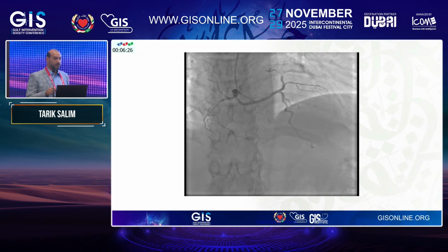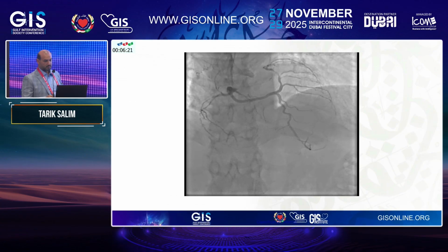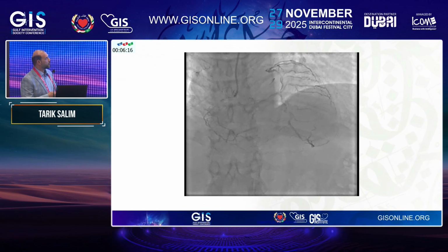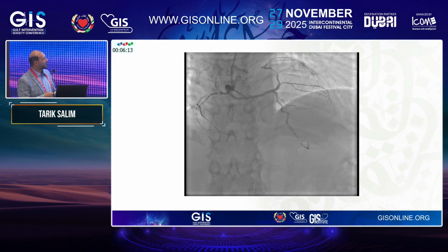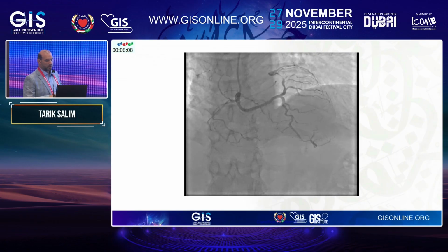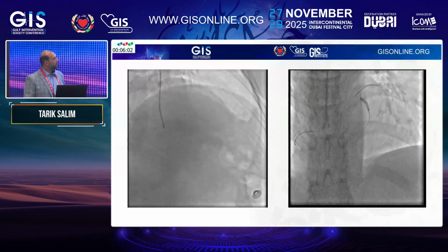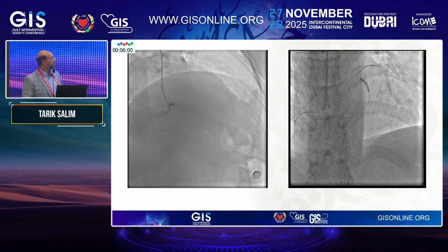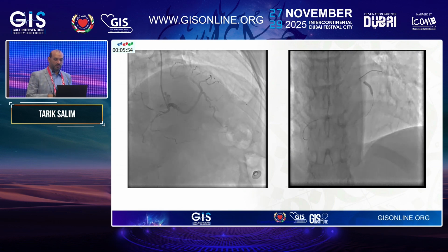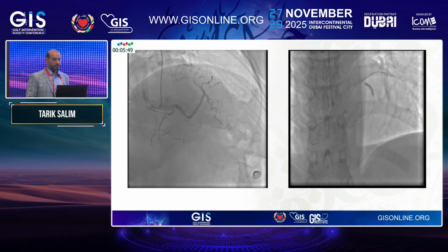So this is the first angiogram, and I basically felt that the lesion is probably here in the obtuse marginal, that is the issue. As you can see here, the whole left main system is coming from the right coronary sinus, and there is a CTO to the right coronary artery. So at this stage, I only treated the obtuse marginal mid portion with preparation, and then finally with a DCB using a SeQuent Please drug-coated balloon.